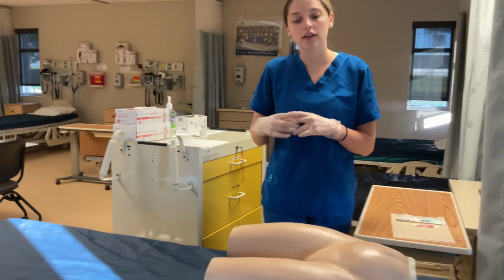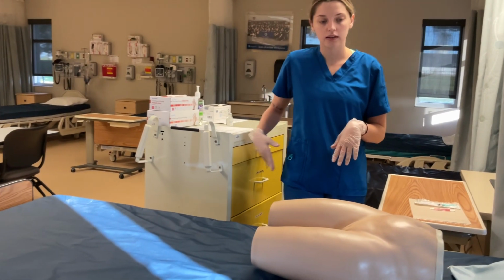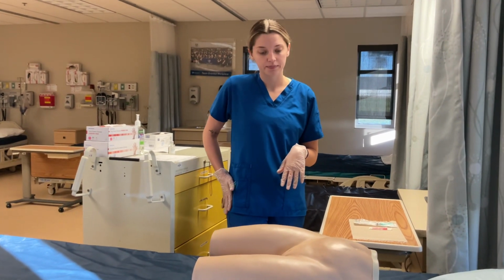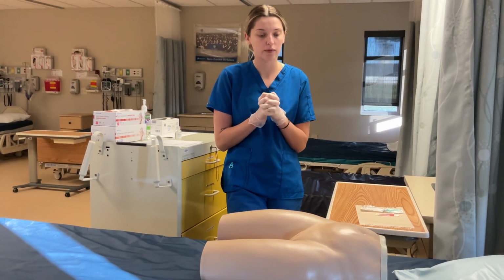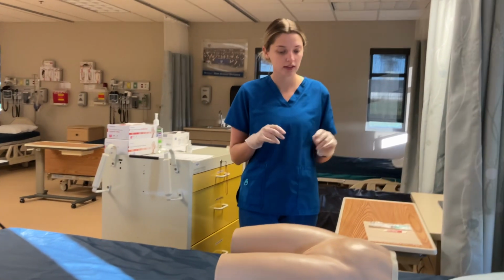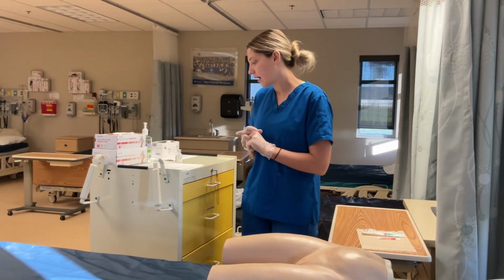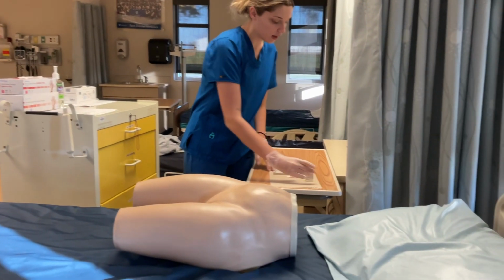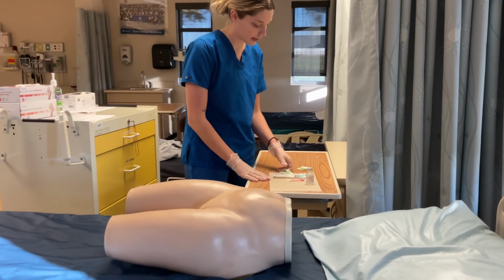Today the route is going to be the greater trochanter, and we're doing that because it's the best absorption place for this medication that's going to be given. And then after that, I'm going to open and prepare the medication in front of the client. The client has the right to refuse and know what they're being given, so I'm going to explain that to the client.